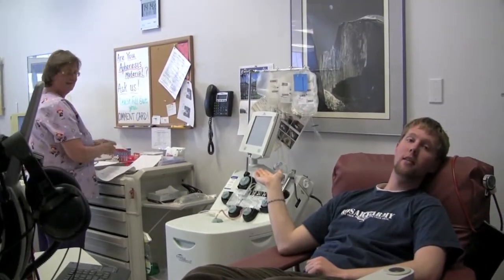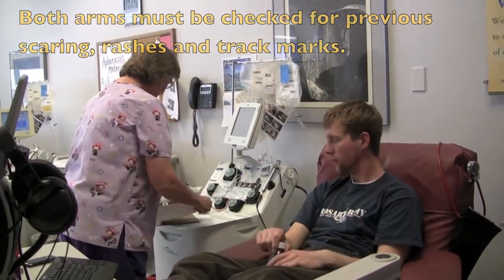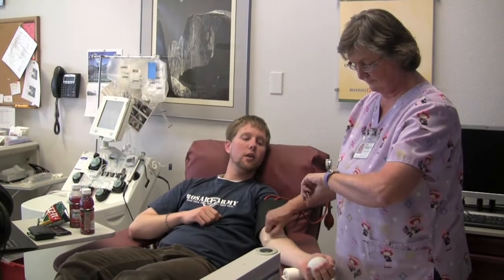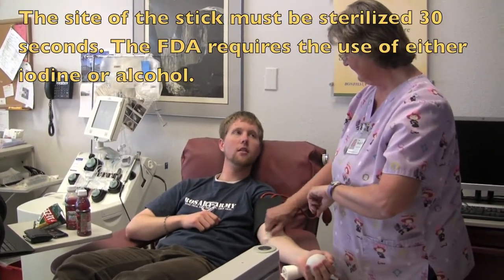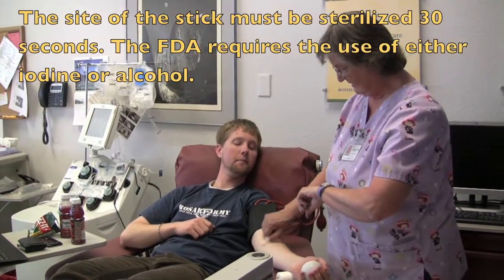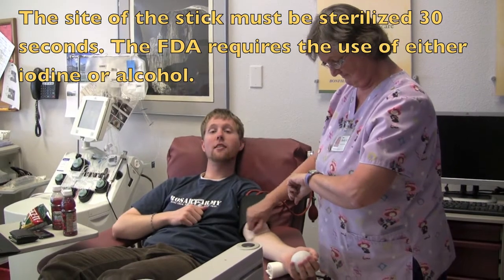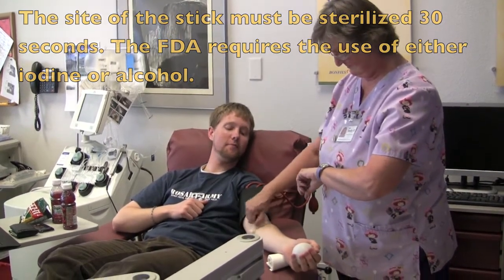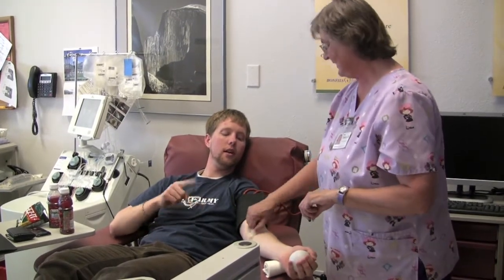This is my phlebotomist, Becky, doing the paperwork over here. So Becky, what are we doing here? I'm scrubbing your arms to make sure we don't get any bacteria in the blood that you're donating, and so you don't get an infection. Infections are not good. And how long do you have to do this? 30 seconds, and I go a little longer. And what are you actually putting on me? Alcohol.